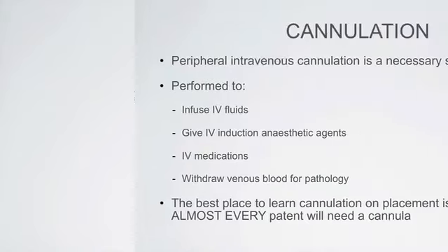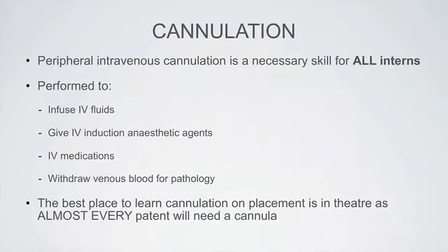So the reasons we perform cannulation are to infuse intravenous fluids, to give intravenous induction anesthetic agents such as propofol, to give intravenous medications such as morphine or antibiotics, and also withdraw venous bloods for pathology. And the best place to learn cannulation is on placement in theatre, as almost every patient will require a cannula prior to their procedure.